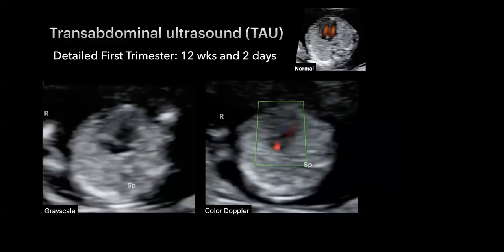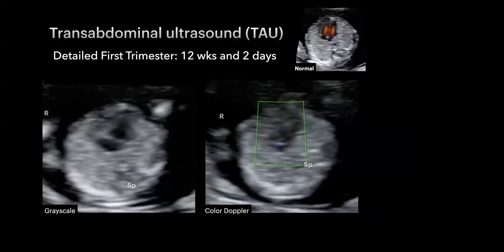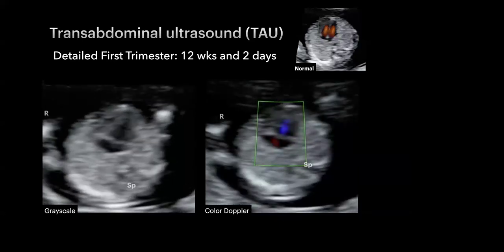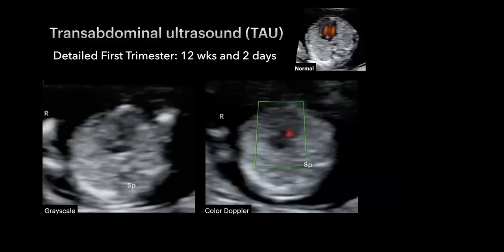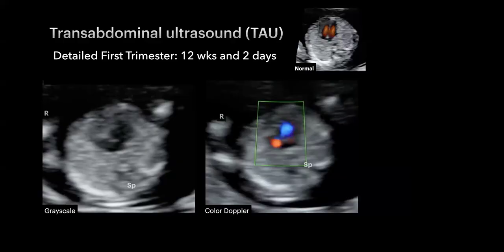Here's an example of a case. This is a detailed first trimester, which we routinely perform at our lab in San Diego, California. We do this anywhere between 12 weeks and 13 weeks and 6 days. We always take a look at these fetuses, especially the heart, as we try to improve our screening for congenital heart defects. We utilize color Doppler.